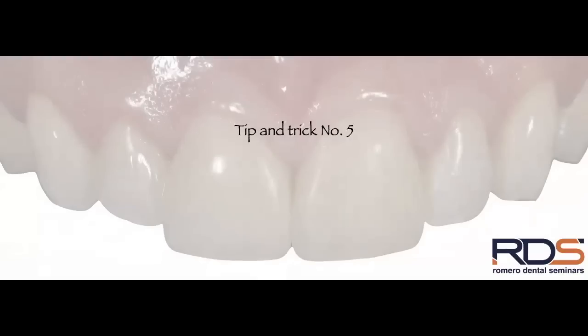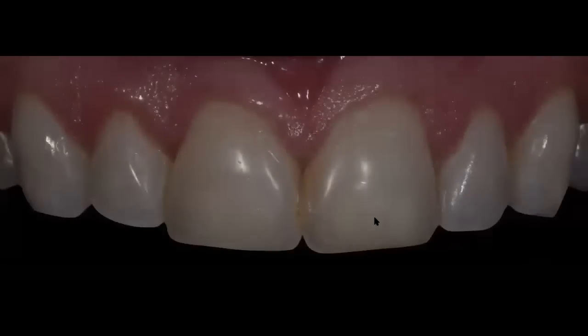Because you will find patients that don't have color gradient or don't have a very accentuated color gradient from gingival to incisal. So in those cases, you may be able to get away with a single shade or maybe a combination of two shades. But you will find many cases out there, mostly on young patients, that have more color gradient, and you're going to have to layer more of these shades in order to achieve an ideal result.